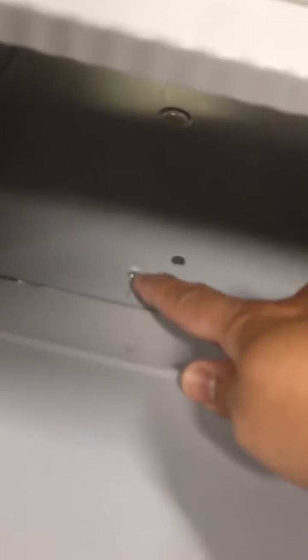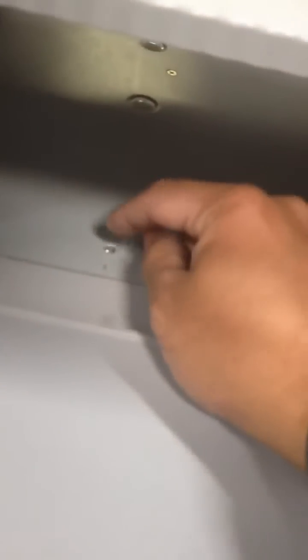Open the bay and check if you have a locking screw in here. If you have one, remove it. After you remove the screw, you can easily remove the panel using the flat screwdriver. And then you can remove it with your hands.